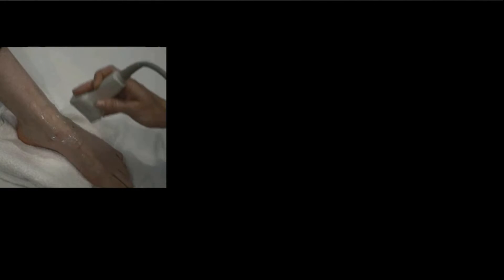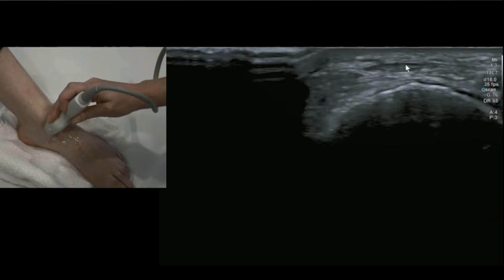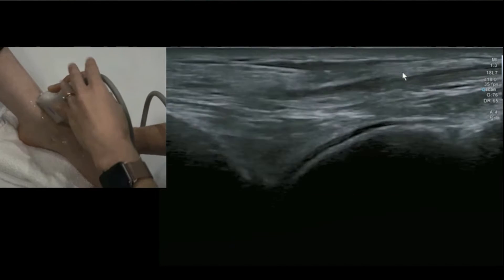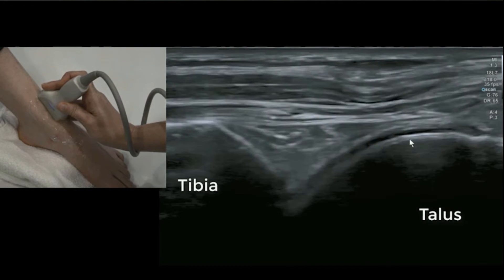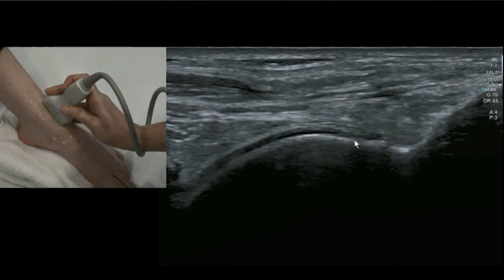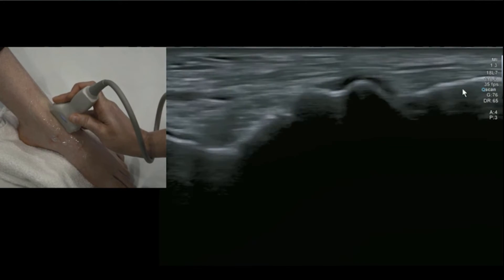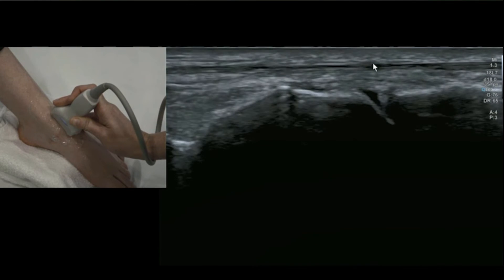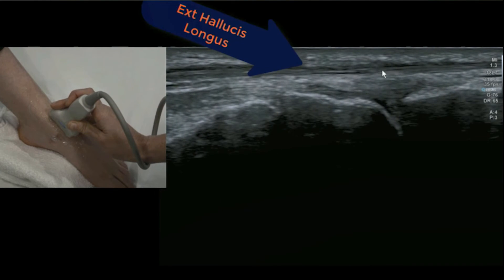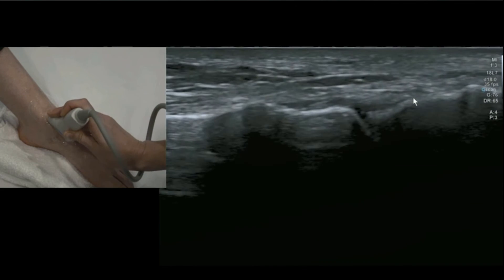Moving medially now, we're looking at the talonavicular joint. Place your probe on the tendons you know well — anterior tibialis and EHL, the hallucis tendon. Rotating into longitudinal on EHL you can identify the ankle joint, the tibiotalar joint. Slide south and you'll identify the double bump of the talus; that big knob is part of the talar neck, and the first joint is the Chopart joint — so this is the talonavicular ligament. You'll be directly underneath EHL; don't forget to move medial to lateral to scan the ligament thoroughly, as it is quite a broad, thick ligament.